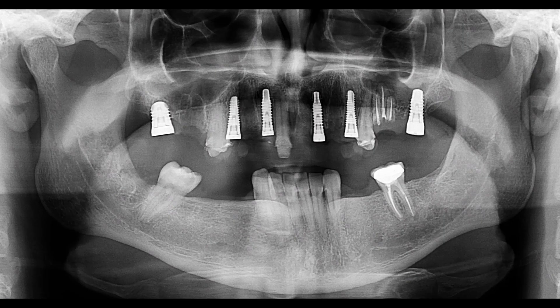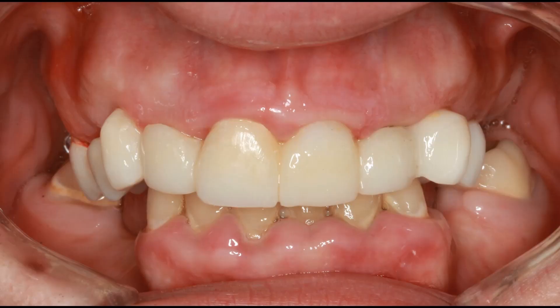Here's the X-ray after the first surgery. You'll notice that we were able to place six implants, but we retained three natural teeth. Of these three natural teeth, none of them are going to stay — they're just serving a short-term purpose of holding the temporary and maintaining the soft tissues that I mentioned earlier. Here is a picture of the temporary that was made for the patient on the day of surgery. You'll notice already that the tissues are improving from a health standpoint, and also that the temporary is putting pressure on those tissues, which will help maintain that architecture that we're so focused on.